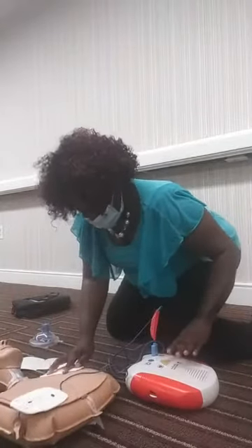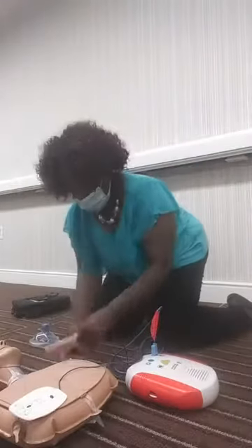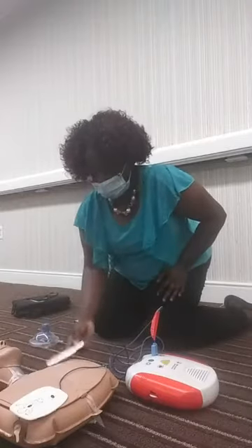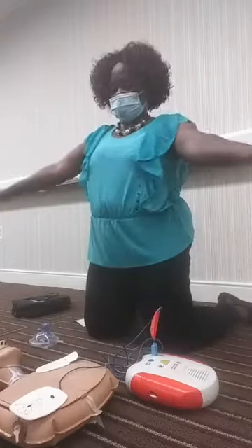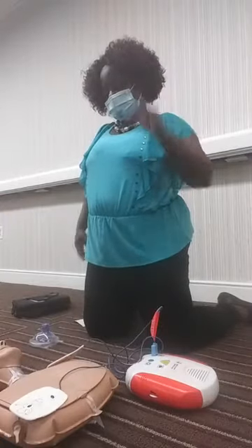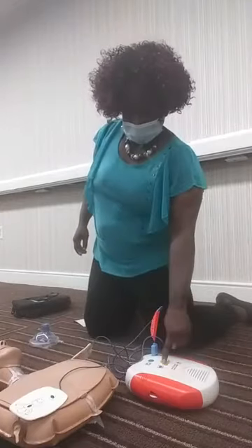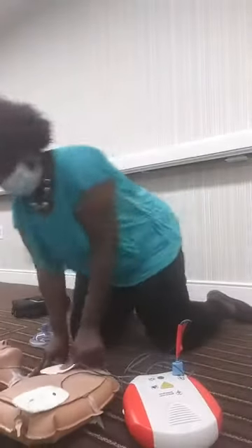The AED will announce: analyzing rhythm, everyone stand clear, all clear. If shock is advised, it will say: shock advised, charging, everyone stand clear, all clear, push the shock button, shock delivered. Then it will instruct you to begin five cycles of CPR and resume compressions.